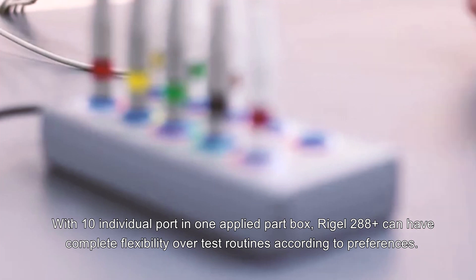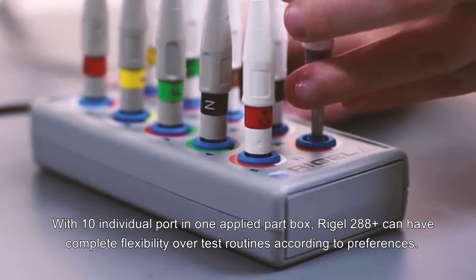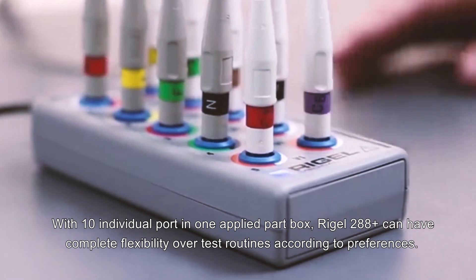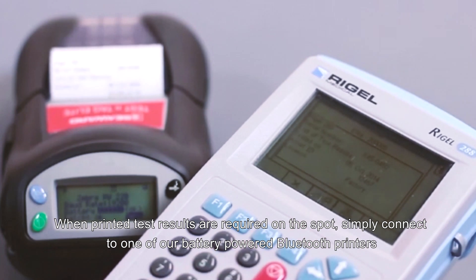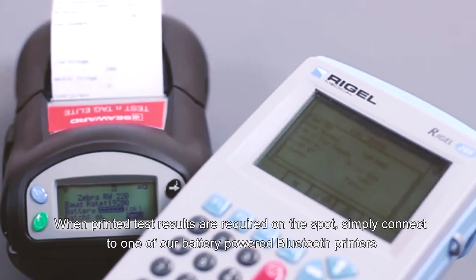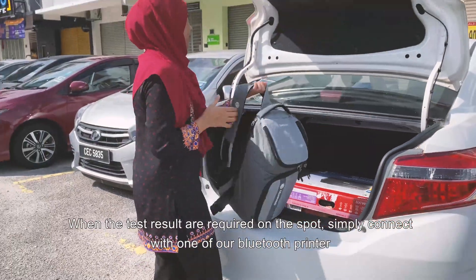With 10 individual ports in one applied part box, the Rigel 288 Plus offers complete flexibility over test routines. When printed test results are required on the spot, simply connect to one of our battery powered Bluetooth printers.